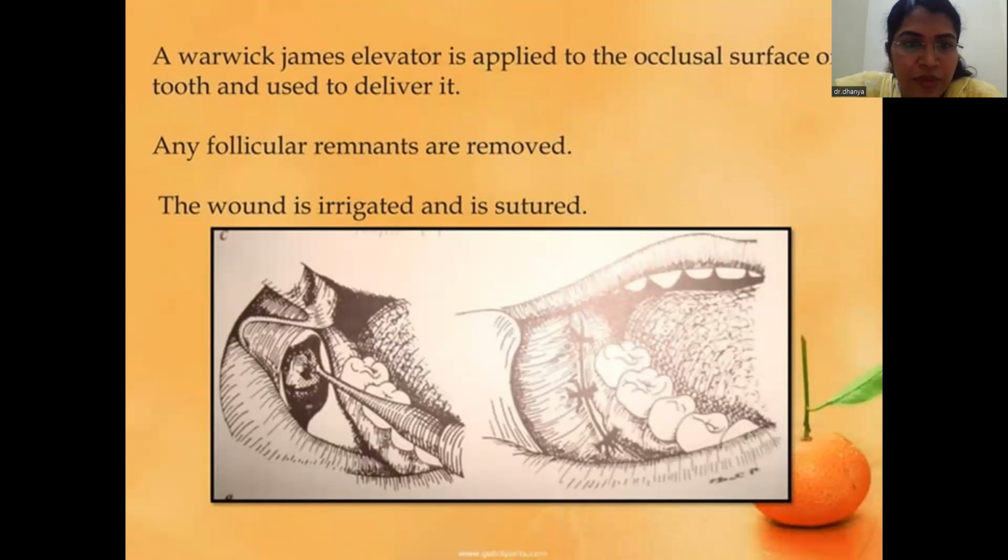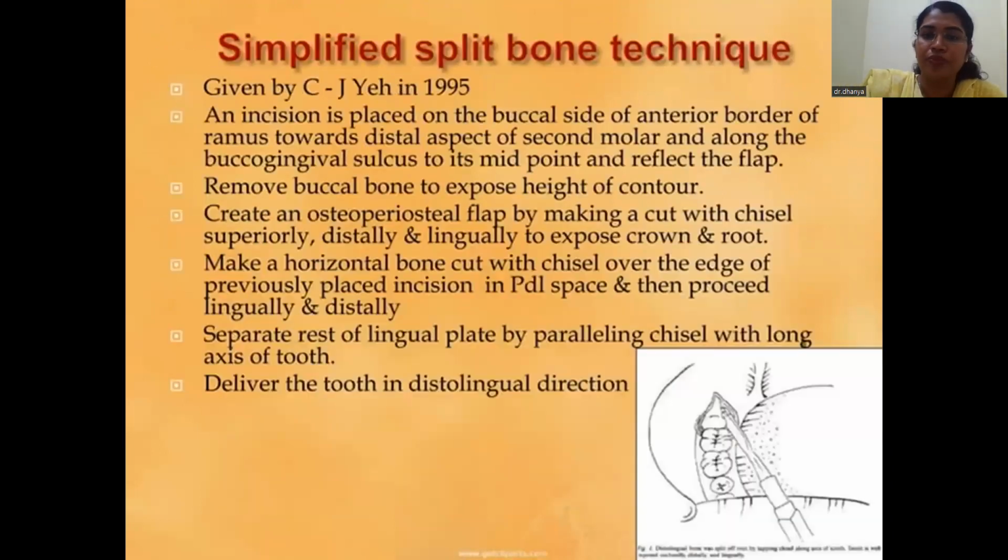All the follicular remnants and everything has to be removed clearly to avoid any kind of cyst formation and pathological formation. And the wound has to be thoroughly irrigated before the closure.